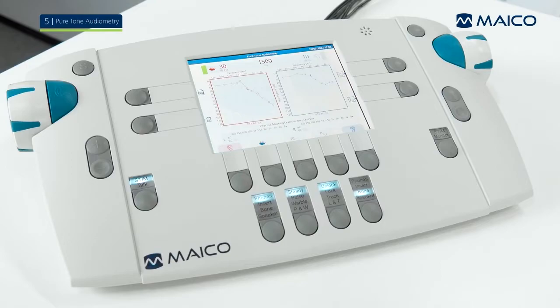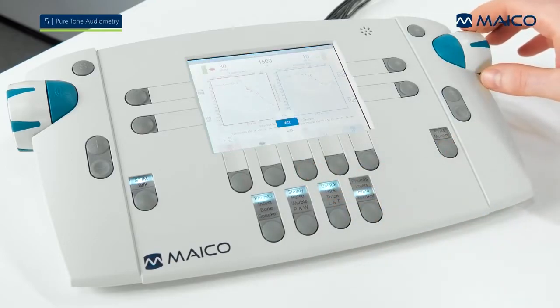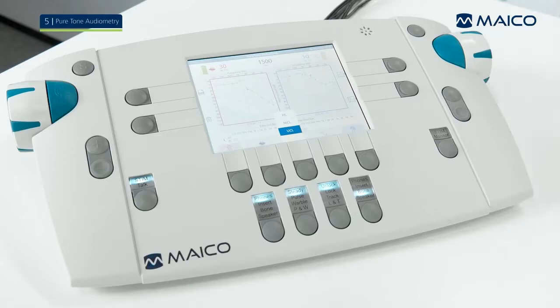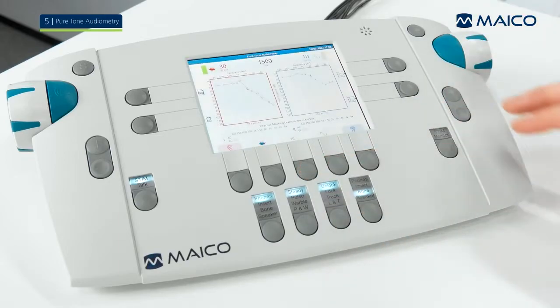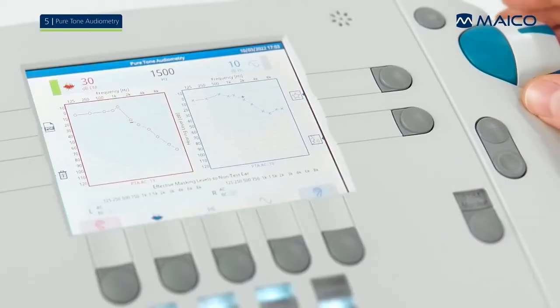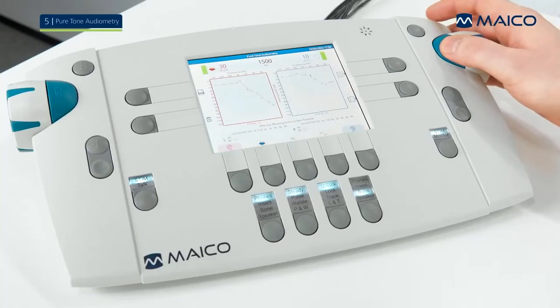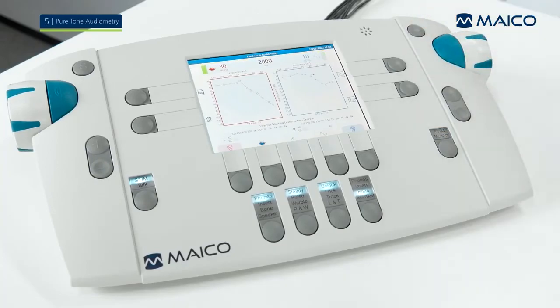In the pure tone audiometry, the test types HL, MCL and UCL are available. If a speaker configuration is calibrated to the MA42, HL aided is also provided for selection. Now select the test frequency and level and use the present key to present or interrupt the test signal. When the patient indicates to have heard the signal, store the value and continue with another frequency or change the ear side.